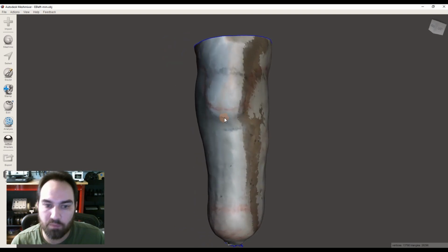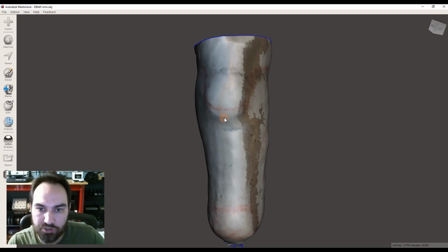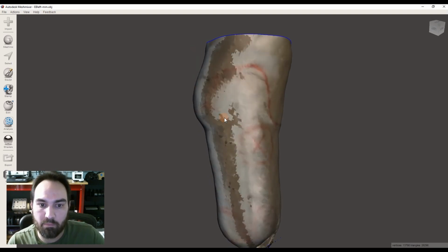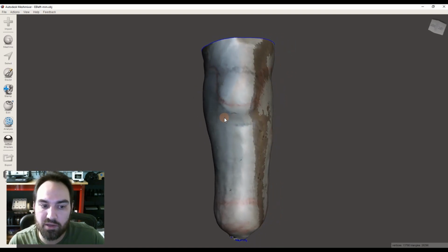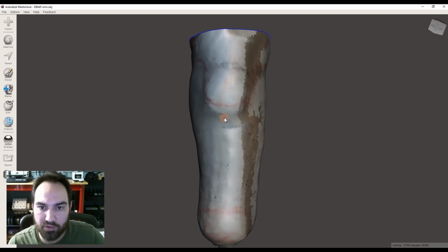The other file type you might see around is a 3MF, which also carries color as well as material data, dimensions, and other things like that. So that's an evolving file, especially in the 3D printing space. So that's a really nice one to use when you have the chance, and we'll see those throughout our different series here.